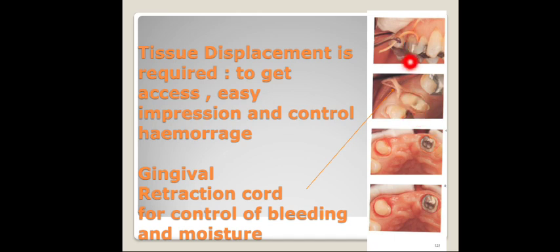Saliva or blood will affect the impression material in these areas near the gingiva, so isolation must be done, and reflection of the gingiva and gingival separation must be done before taking the impression.